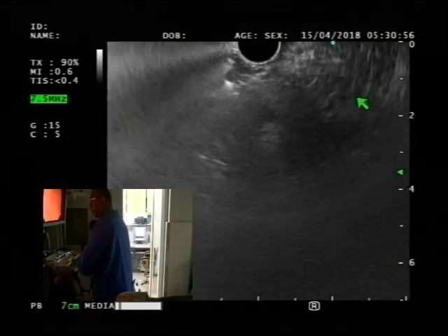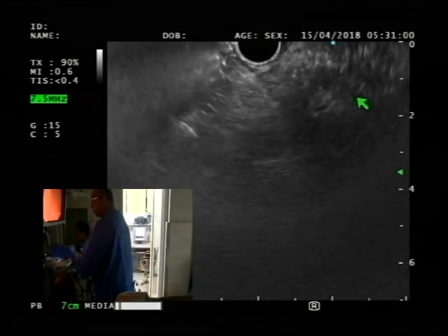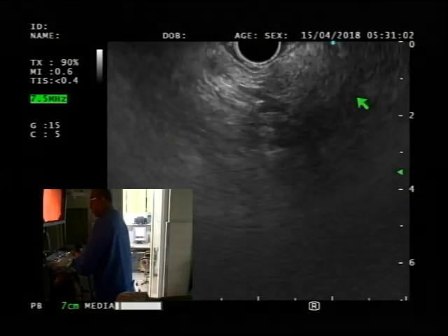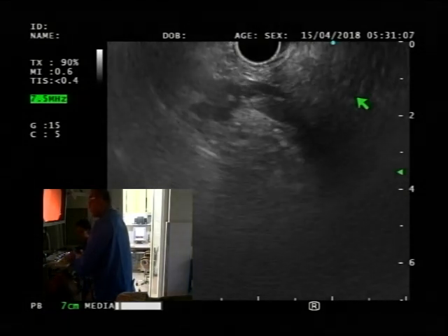Like a pathologist, then that makes life much easier. You're right. Focus fill in, I don't know whether I do that. But at least I can say, so we're still waiting, Khalid.